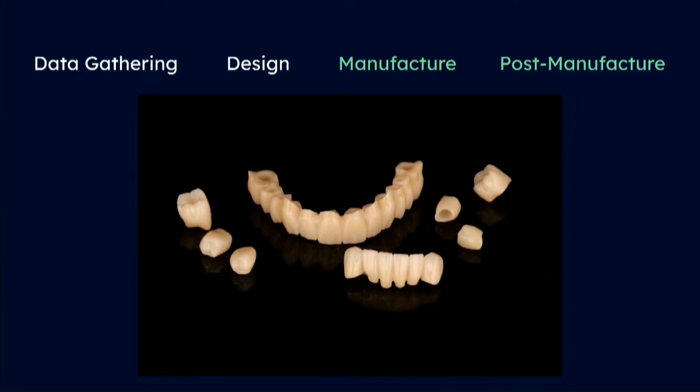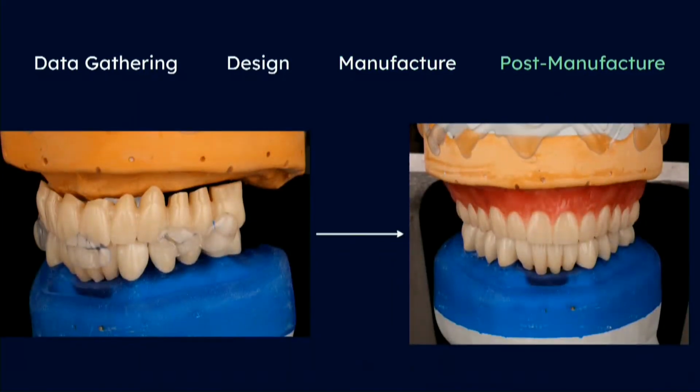If you look at the apical aspect of these maxillary teeth, you will find cylindrical shapes milled out of them by design to, 1, reduce the weight of the prosthesis, and 2, to retain the zirconia and the acrylic of the maxillary denture. These maxillary teeth were designed such that they index on the mandibular restorations, allowing for picking them up to the maxilla via regular base plate wax to then be processed like any other conventional denture.